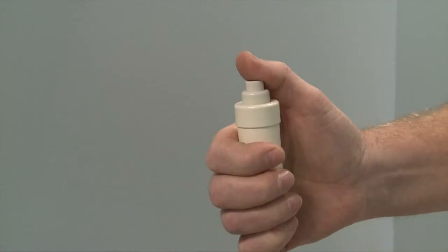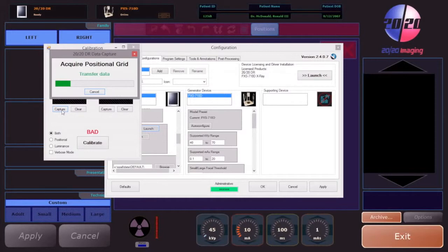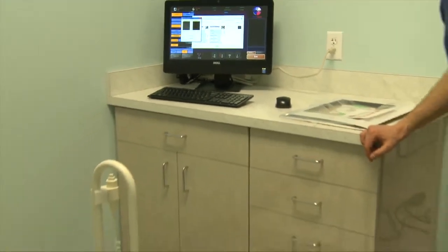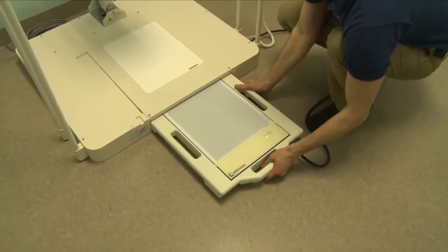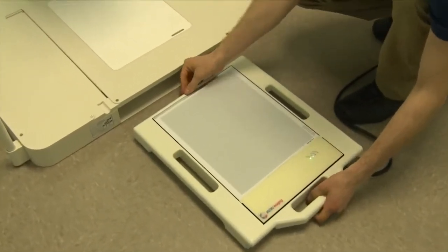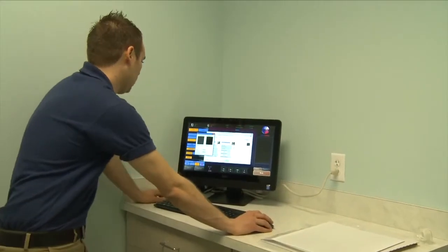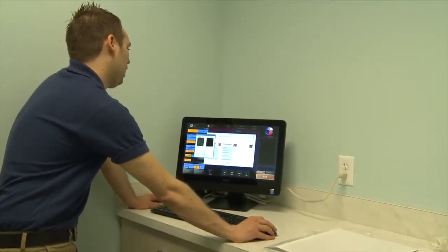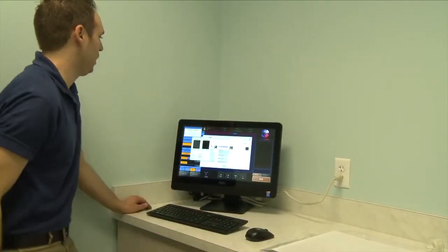We're now ready to take our exposure. Now that our positional view is finished, we'll go ahead and remove the grid from the panel. Back at the computer, we're going to go ahead and select our luminance shot. Now click capture under luminance. We'll now take our exposure.